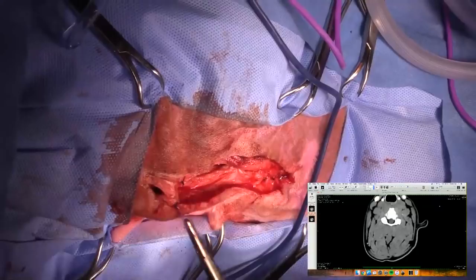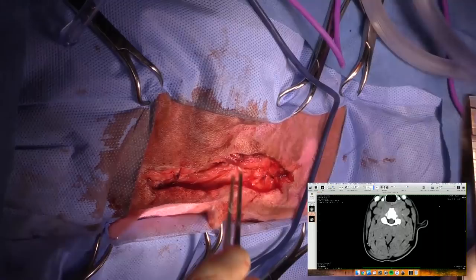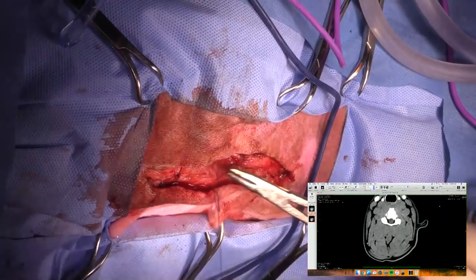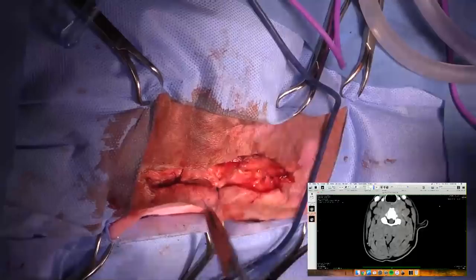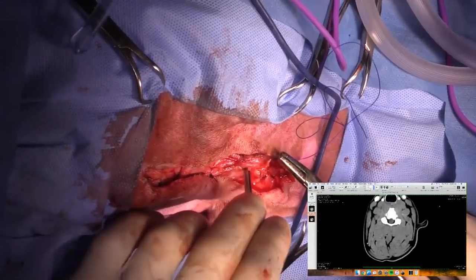So I'm just doing some little interrupted sutures here to get everything generally in place, and then we'll do an intradermal. There's also a question about if we cut any nerves in this area. Really, there are no nerves that we're concerned about. You're going to run into some spinal accessory nerves and that sort of thing. If you go to the base of the ear canal, you could run into the facial nerve. If you were right up against the trachea, you could run into the recurrent laryngeal nerve and maybe the vagus nerve. But if we're superficial out here and certainly superficial to the salivary gland, you're not going to run into any important nerves at all.